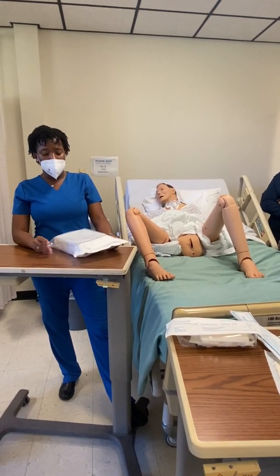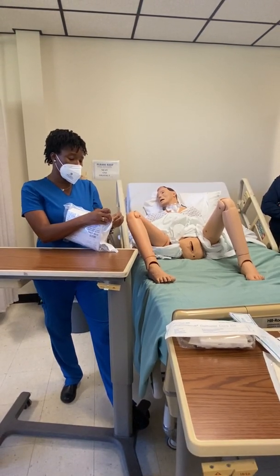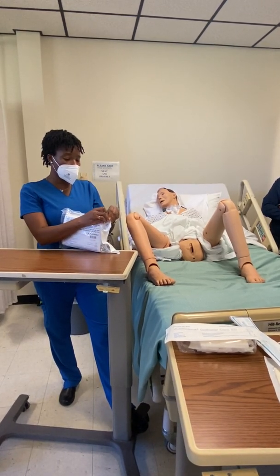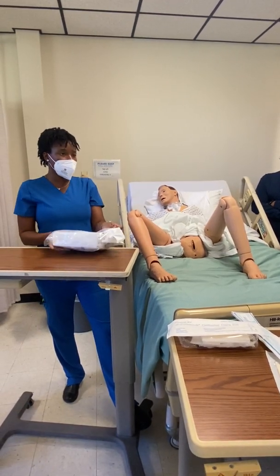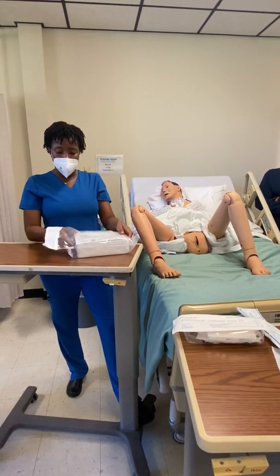Don't get anxious about it, you guys. You see this little flap at the end? It peels up. And it don't want to let go right now. But it's going to peel up, okay? And then it just comes open. Okay?